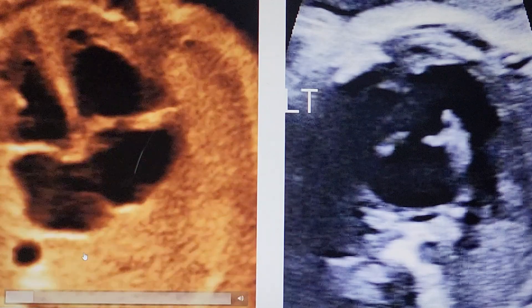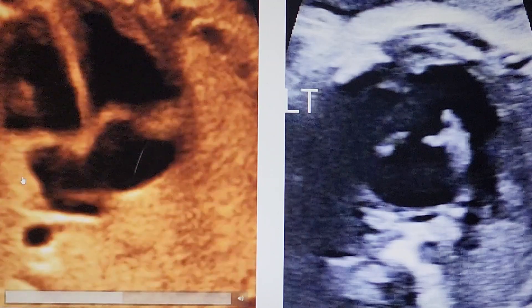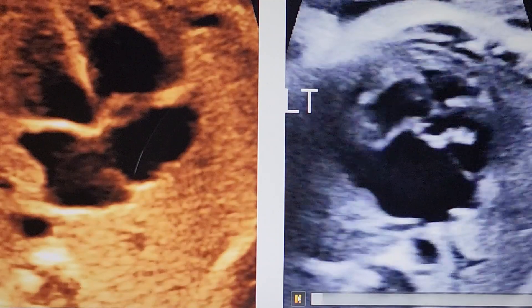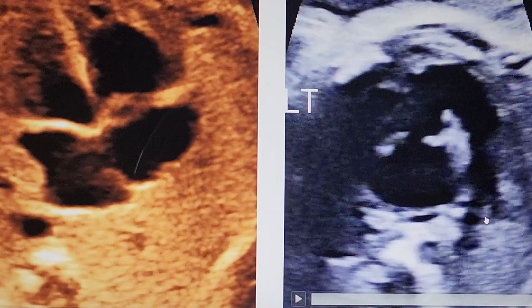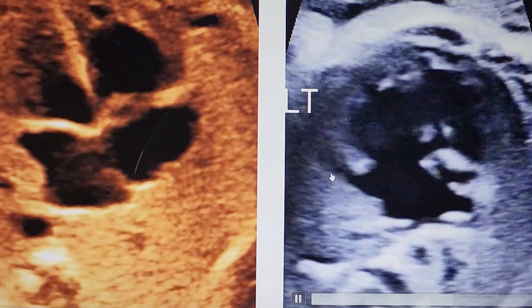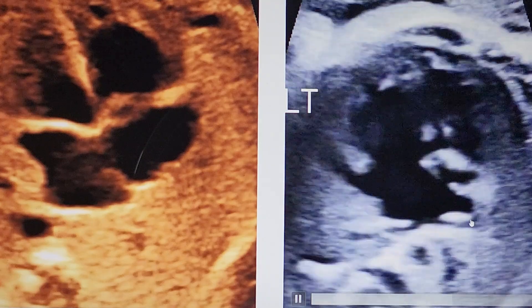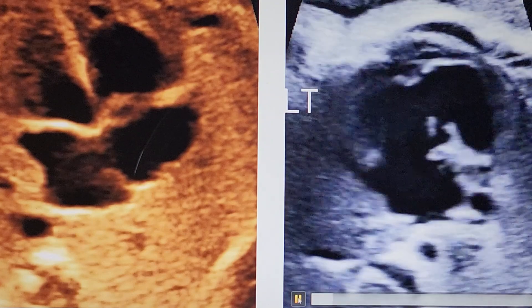Now look at the appendages. In a normal heart, the right atrial appendage is broad-based, while the left atrial appendage is narrow and finger-like with a smaller base. In this case, on the left side of the atrium there is a finger-like narrow appendage, and on the right side of the atrium there is also a finger-like narrow appendage. Both appendages have left atrial appendage morphology, which gives us the clue that we may be dealing with left atrial isomerism.